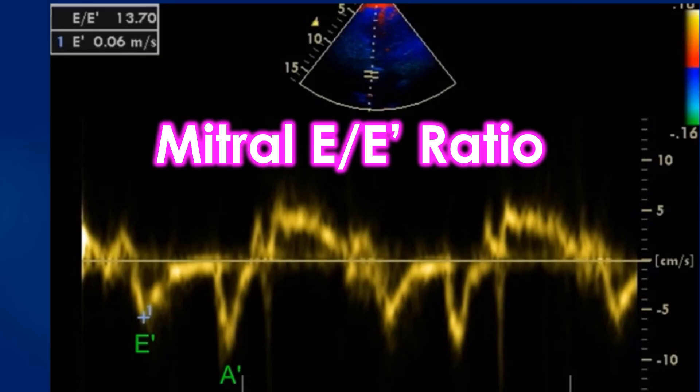In this case, the ratio is given as 13.7. It may be noted that the Nyquist limit for the Colored Tissue Doppler is 0.16 m per second in this image, while it is 0.65 m per second in the following image for Colored Doppler Imaging. This is because the blood flow velocities are much higher than the velocity of tissue movement with systole and diastole.